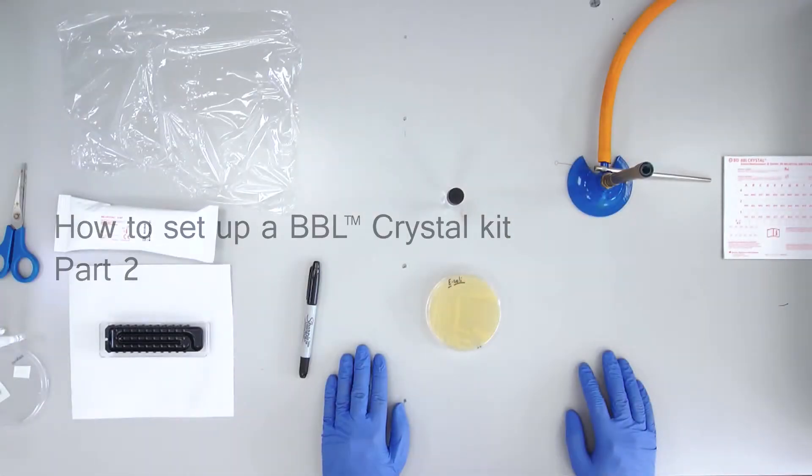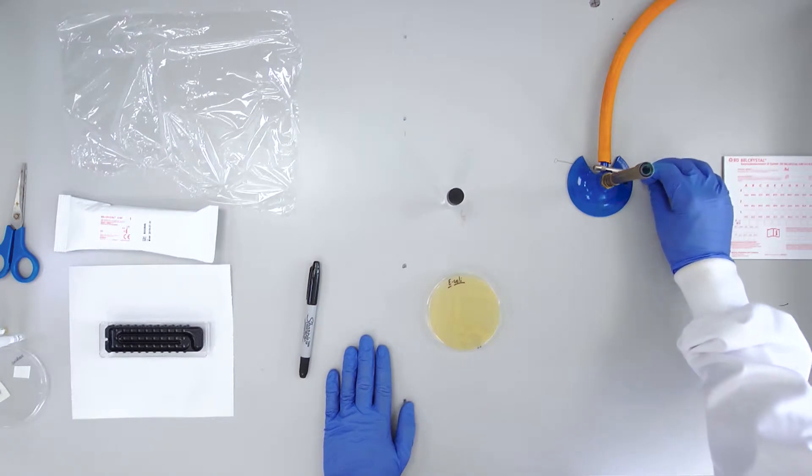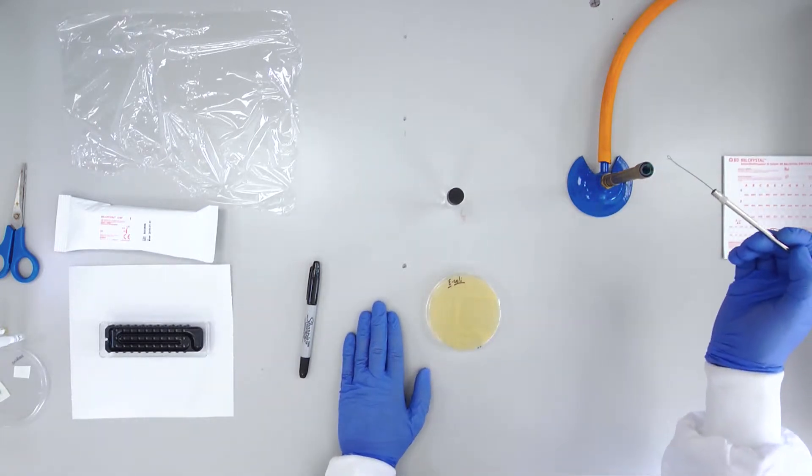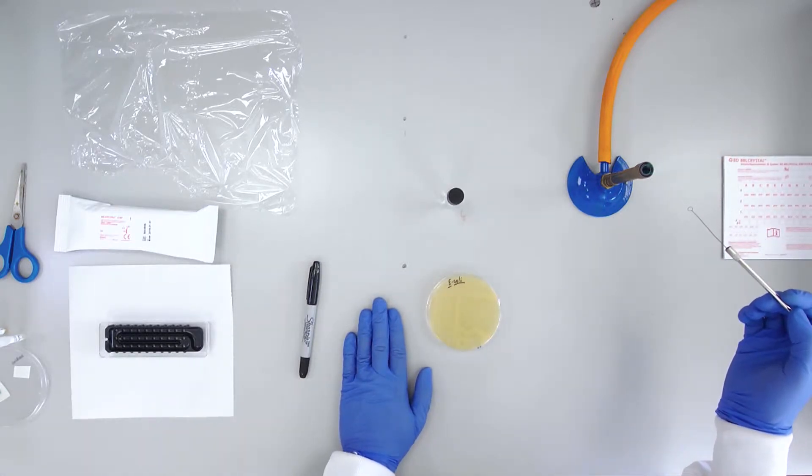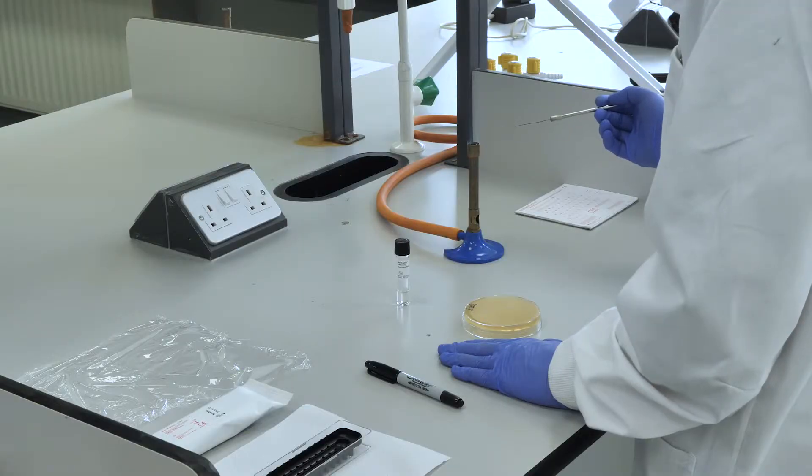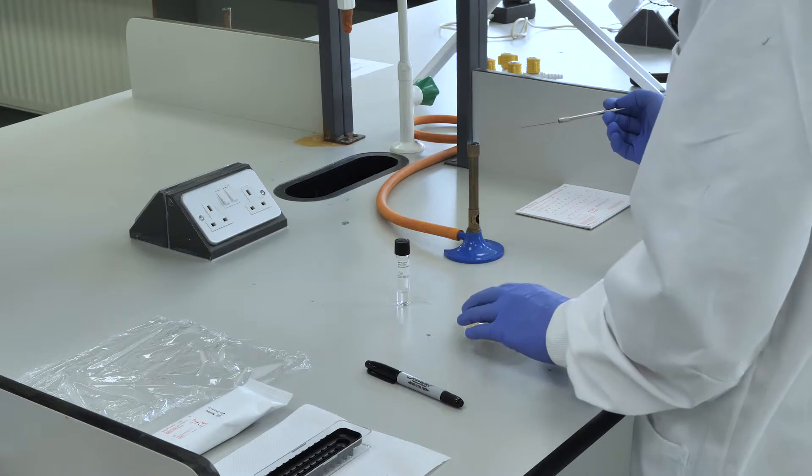How to set up a BBL crystal kit. To set up the BBL crystal kit for identification of enteric bacteria, begin by selecting a large isolated colony from the plate.